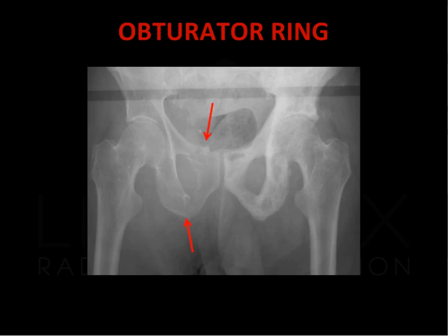Note the increased sclerosis, cortical, and trabecular thickening of the left hemipelvis in the setting of Paget's disease.